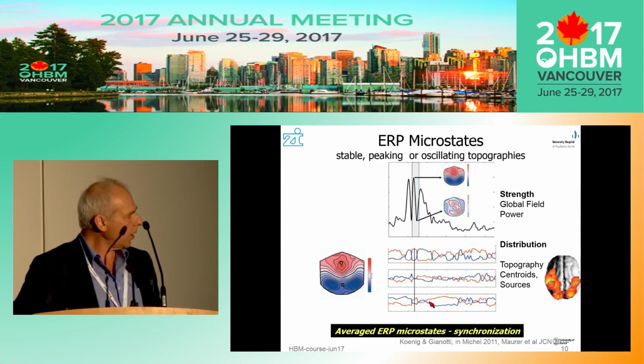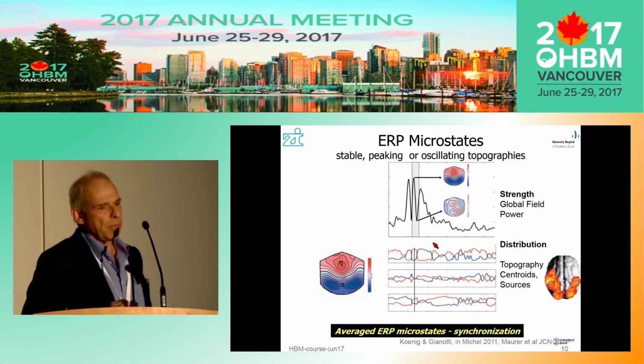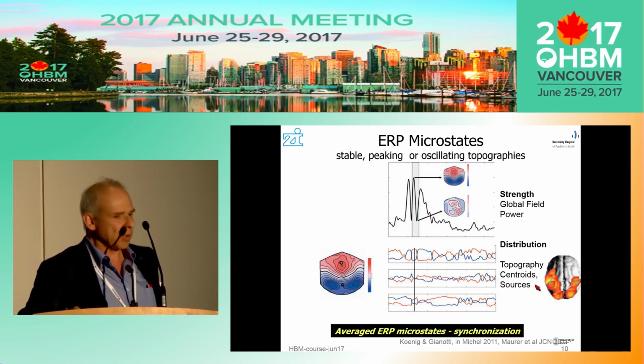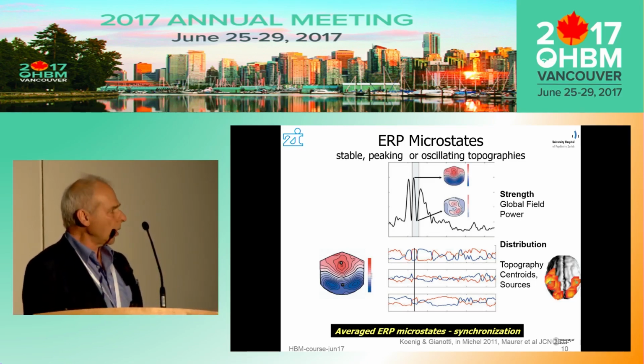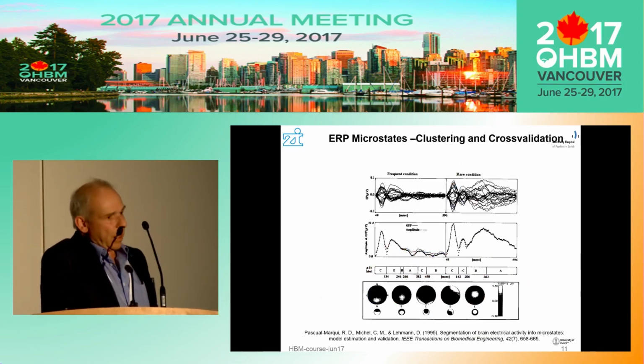And this is a very typical pattern that you can see. This is a visual N1 component with essentially at least two major bilateral generators, which are typically activated in synchrony. And many of the approaches and the source localization will tell you that these two sources are activated in synchrony, turned off in synchrony, and then oscillate or are replaced by a different activation pattern. The way to classify this propagation pattern into microstates, and then from the microstates to look at essentially propagation of the information flow has been described before.